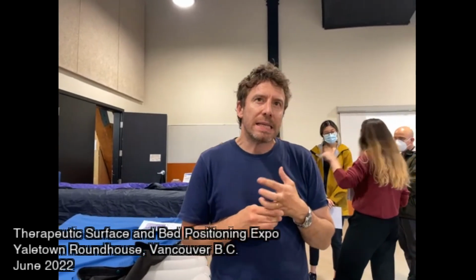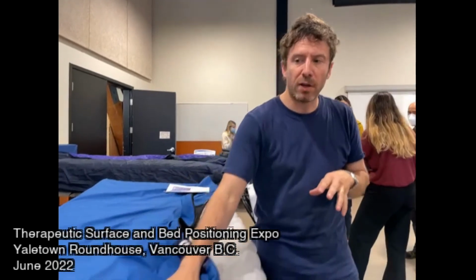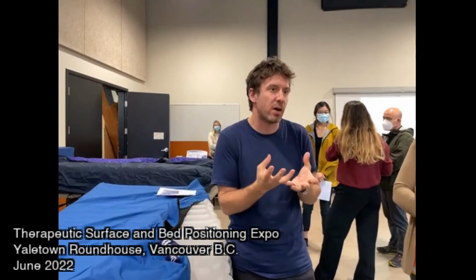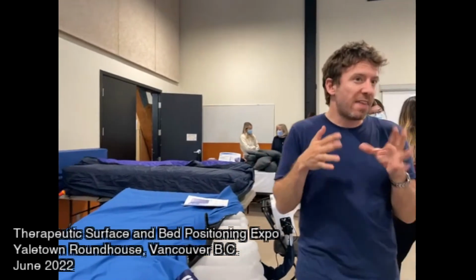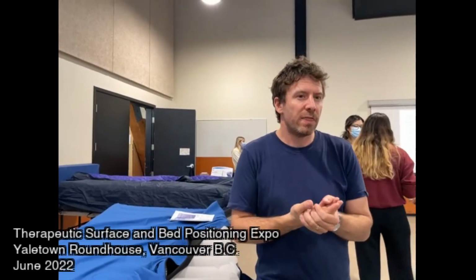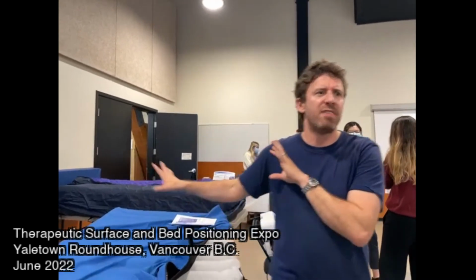But more anecdotally, if you were to lie on this one, for example, with the cover on top, you can't even really feel the airflow. It's very subtle, so it's not going to be enough to make a major change. Whereas on this one, it's that 1,000 liters of air a minute. You can really feel the airflow. So if we do say moisture, incontinence, we want to have the higher airflow.